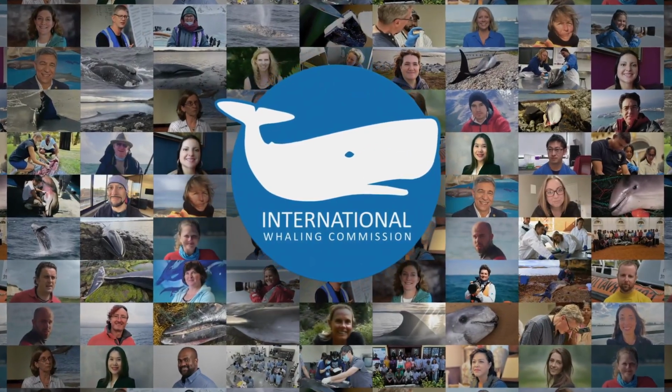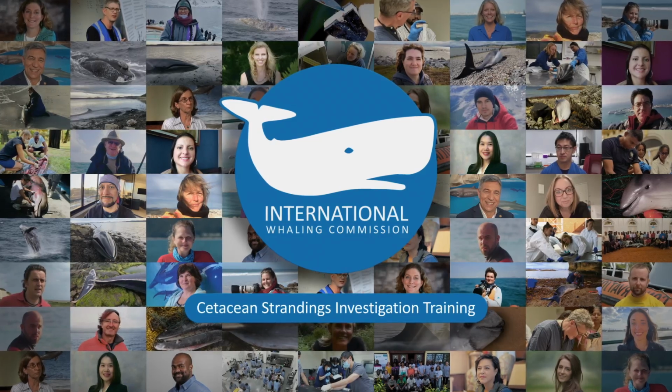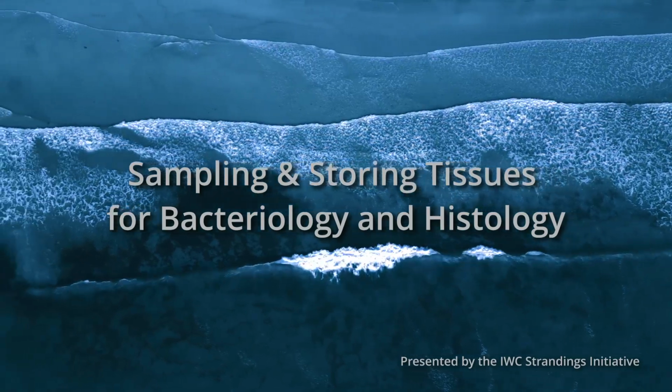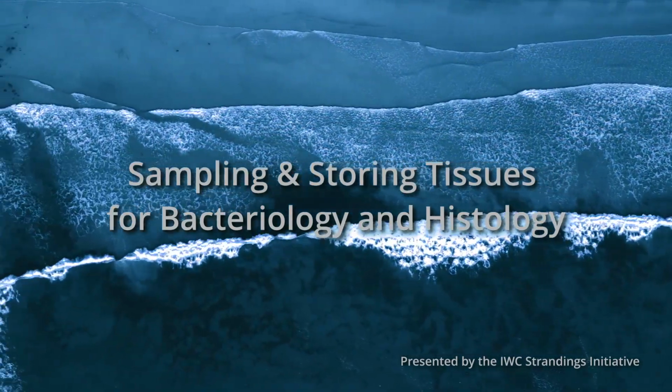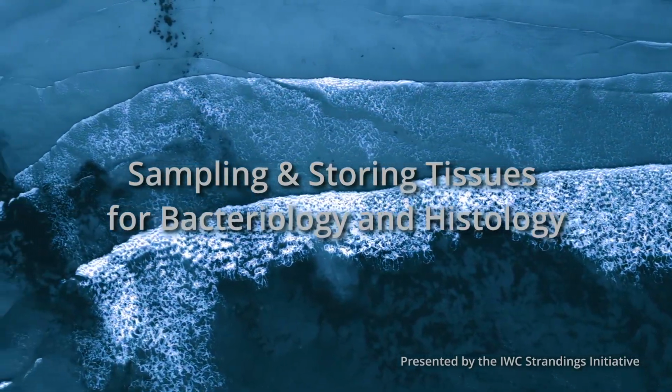Welcome to the International Whaling Commission's Cetacean Strandings Investigation training videos. In this video, we demonstrate best practices for sampling and storing tissues for subsequent microbiological and histopathological examination.